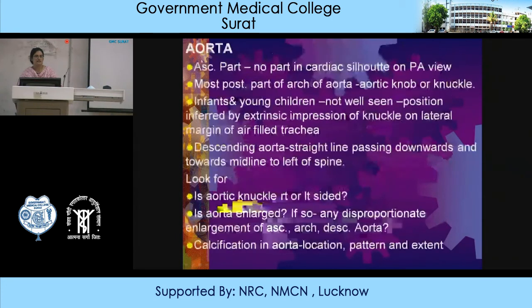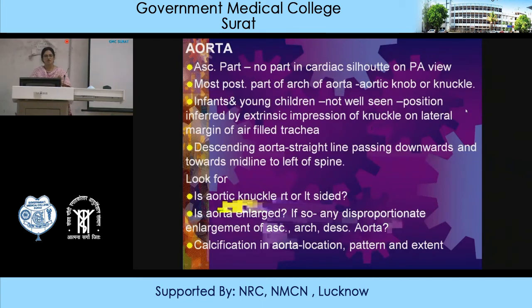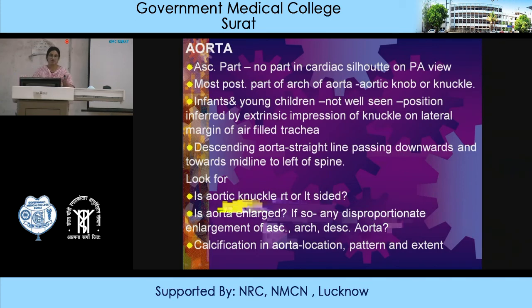The ascending aorta does not form any part of the cardiac silhouette on the PA view. The most posterior part of the arch of the aorta forms the aortic knob or knuckle. In infants and young children, the aortic knuckle is not well seen and its position is inferred by the extrinsic impression on the lateral margin of the trachea. The descending aorta is a straight line passing downwards to the left of the spine. You should look whether the aortic knuckle is right or left sided, whether the aorta is enlarged, and check for any disproportionate enlargement of the ascending aorta, arch, or descending aorta, as well as calcifications.